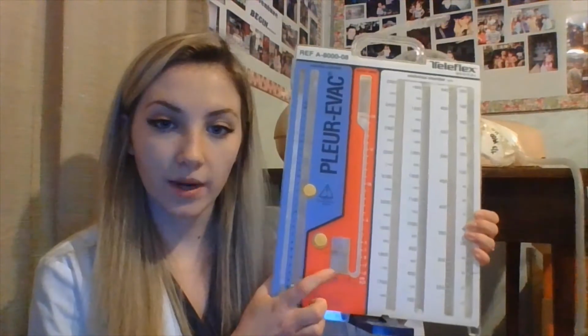We briefly discussed earlier that if there's bubbling in your air leak monitor, which is this section right here, then that could mean that you have an air leak somewhere in your tubing. However, if your patient has a pneumothorax, intermittent bubbling in this area may be normal. So it's very important that you know your patient history for this reason.